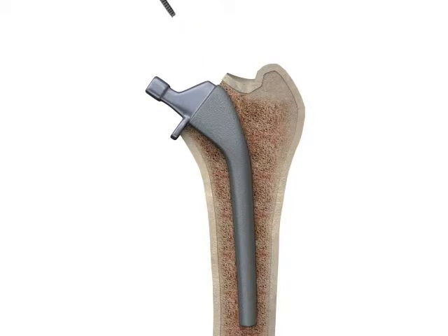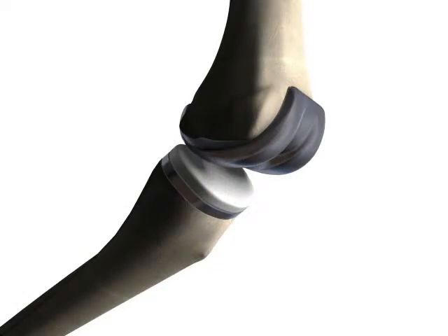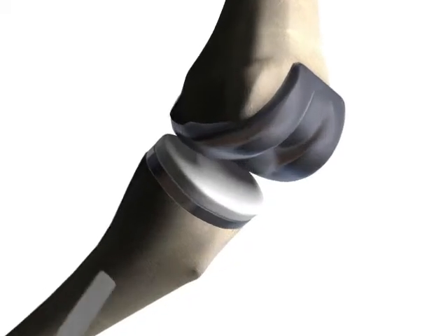After the interface has been completely broken, a slap extractor can be used to remove the prosthesis from the canal. The steps in removing the tibial component with the OSCAR bone cutting probes are similar to the stem extraction steps in hip revisions.